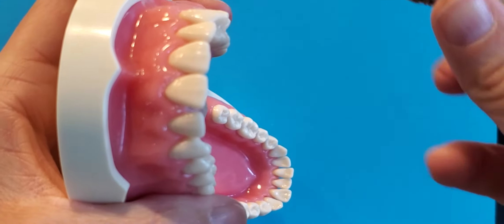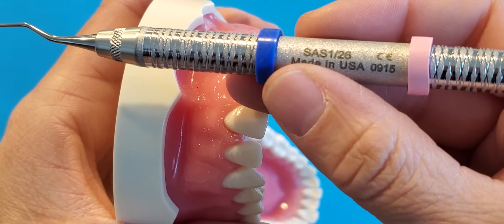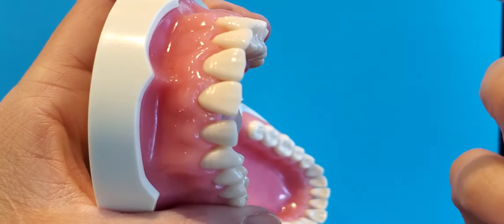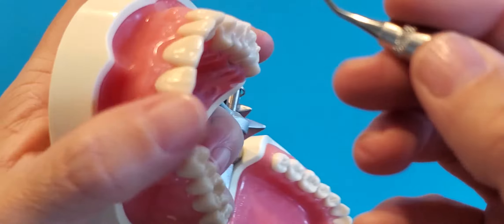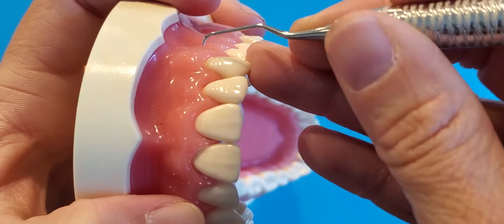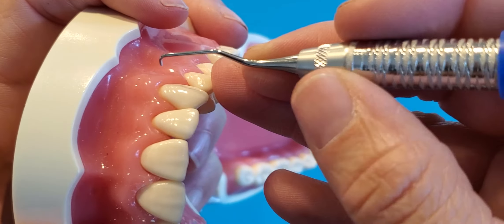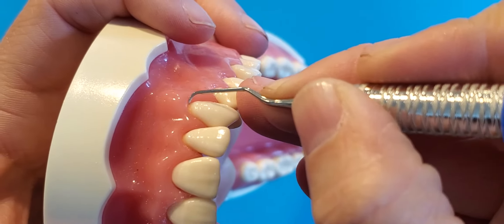Let's talk about sequencing with the Gracey 1/2. This is the Gracey 1/2 instrument, and what I would suggest is that you take anterior sextants and work in sextants. That's if you have deep pockets and you need a Gracey on every surface of every tooth.